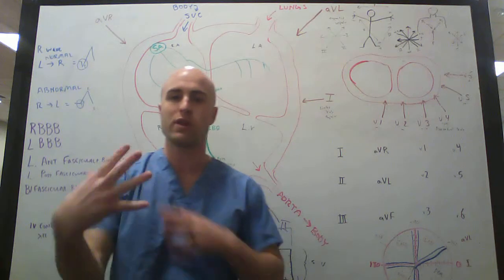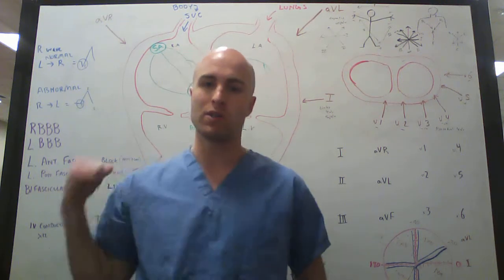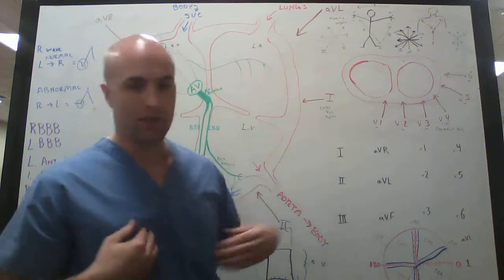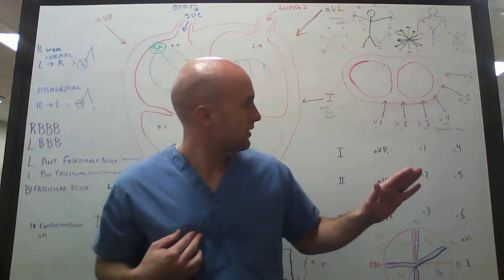This is giving us a three-dimensional view of the heart, what's going on. So this one is coming from forward to back. And so starting out, the first lead is going to start here, on the right side.